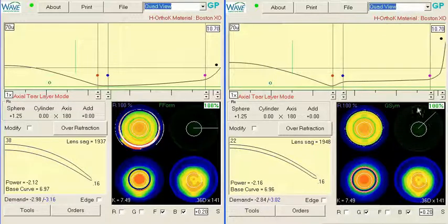And then just double check our meridian. Might be able to get closer on this side. No, I think I'll leave it. So these are two potential designs that I think we could try. And hopefully both of them will kind of get your patient closer to target.